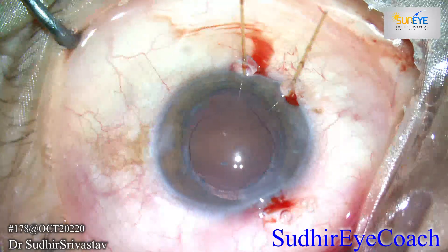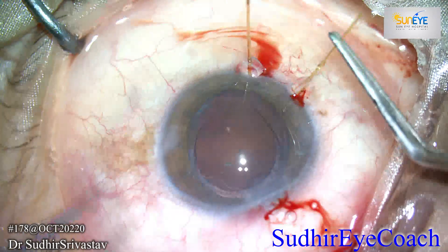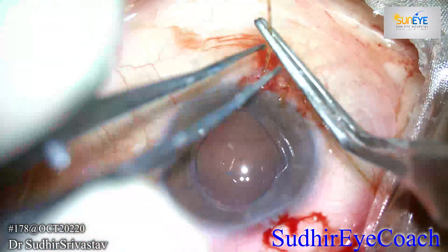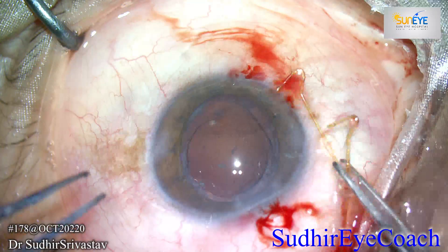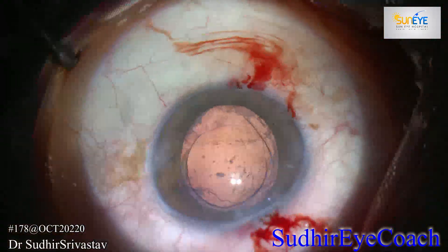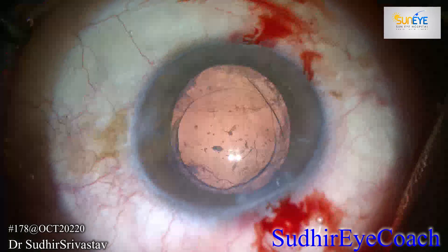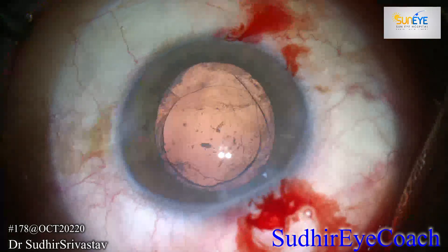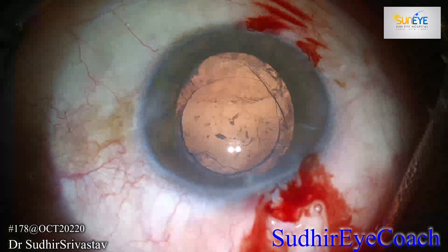Now take a break and again fill the chamber with viscoelastics, and again assess the area of subluxation. You can readjust your capsular support, or you can remove it. Here I thought to remove the capsular support because I felt the capsule was quite stable and I could do cortical cleanup without any problem.